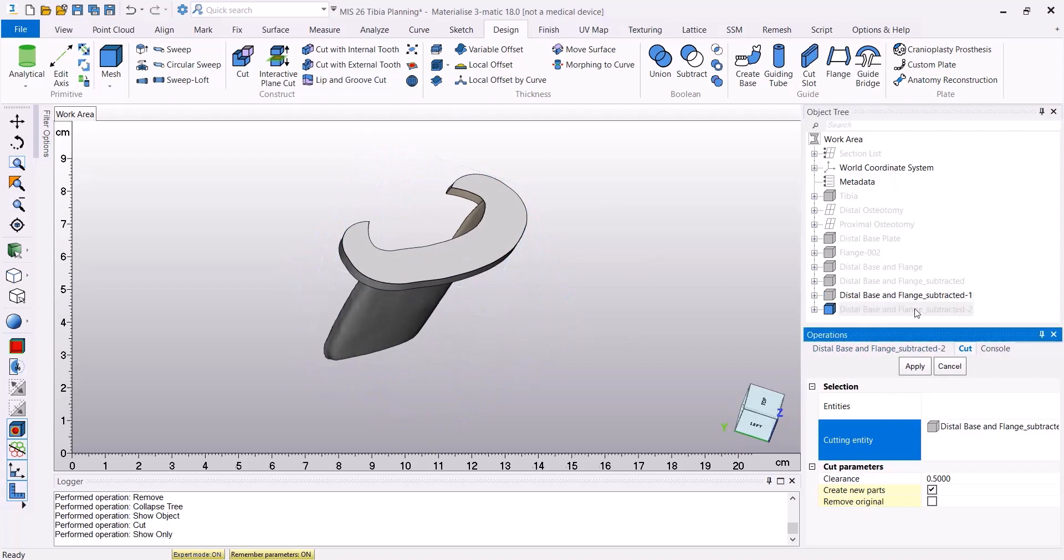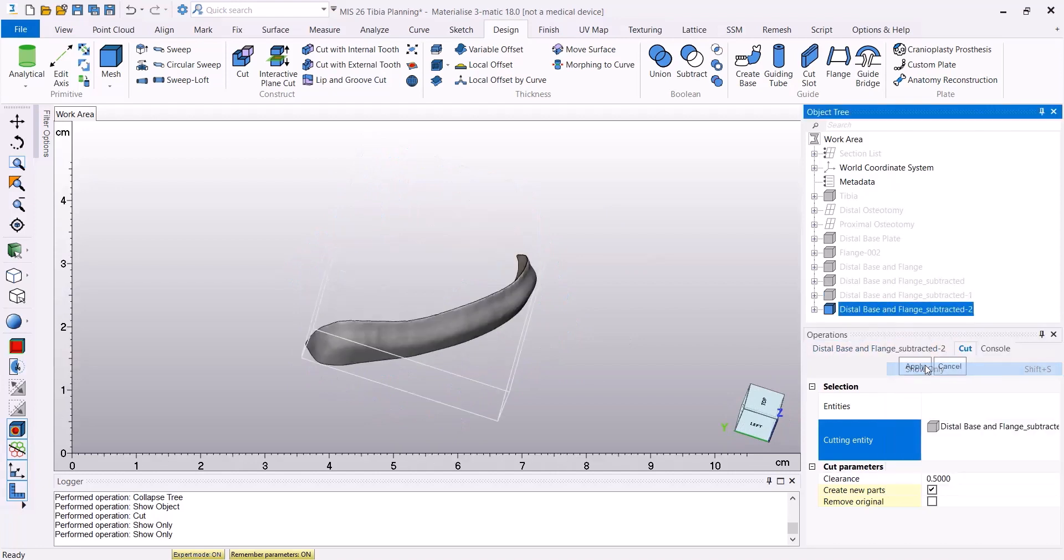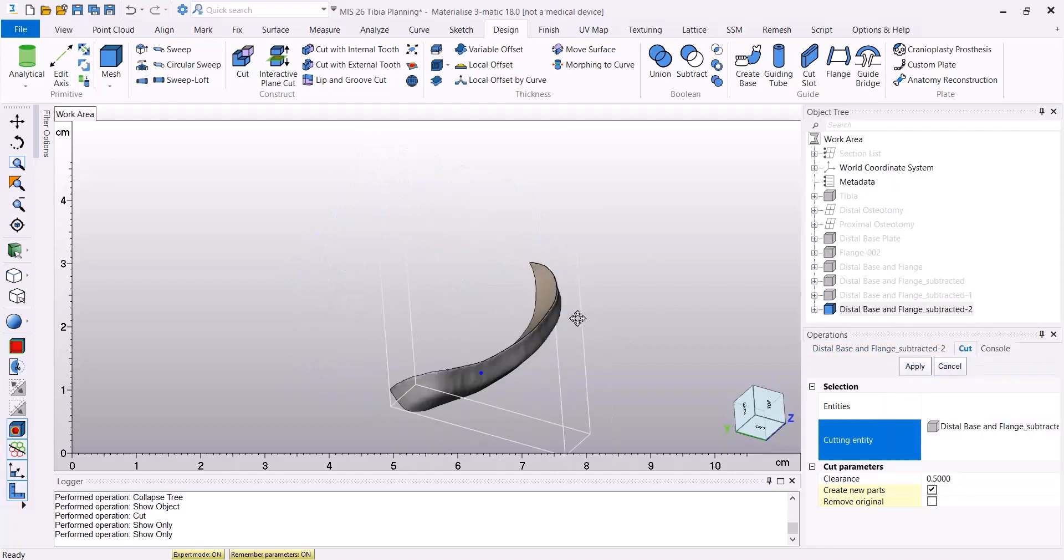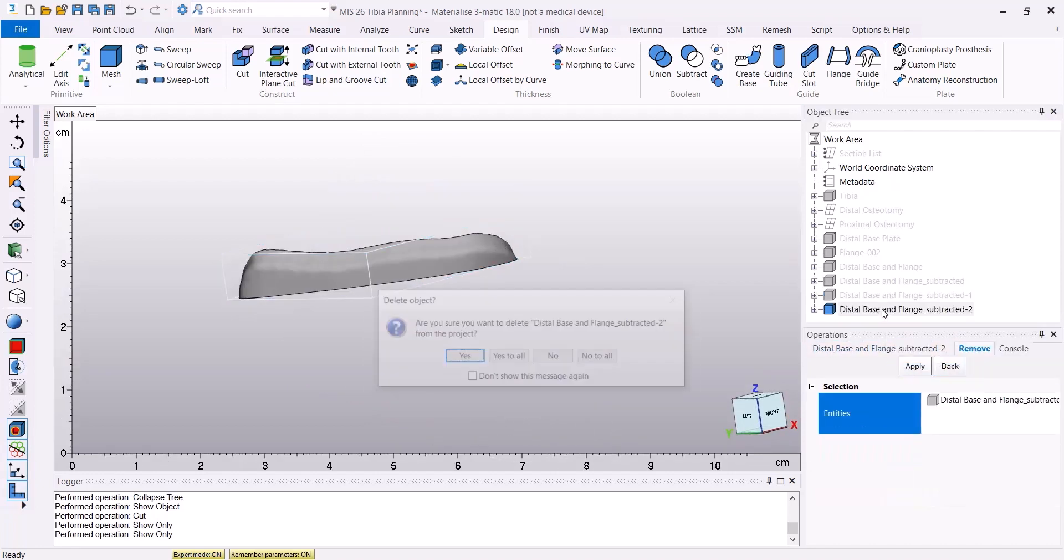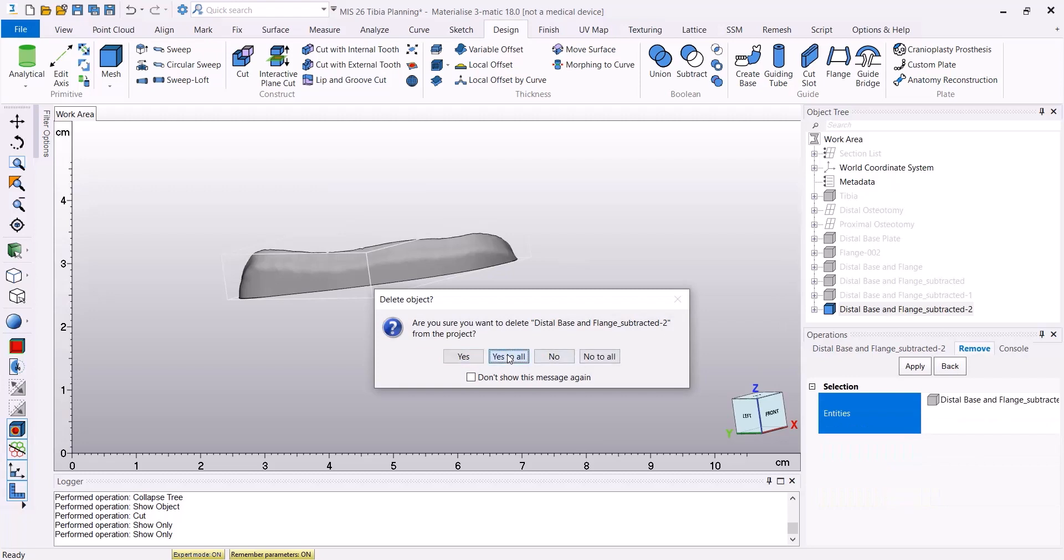Now I'm going to have two parts in my object tree as a result, and the upper part, which is of no interest for us anymore, can be removed.